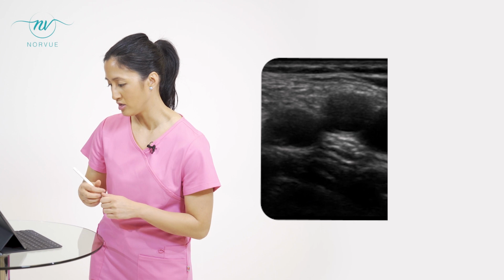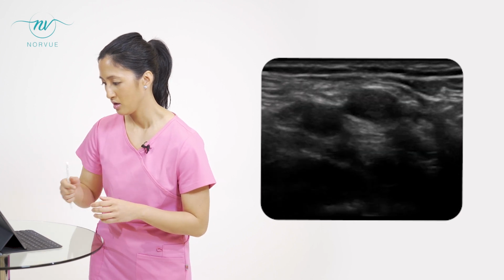So let's summarize the femoral region. Start by identifying the common femoral vein, and you have to know the difference between the vein and the artery. So use the signs like the wall thickness, the pulsation, whether it is compressible, and color Doppler to differentiate blood vessels, whether it is an artery or a vein. So this is a video showing this.